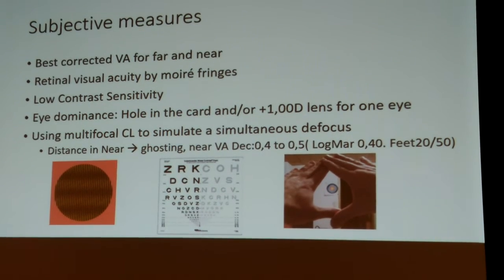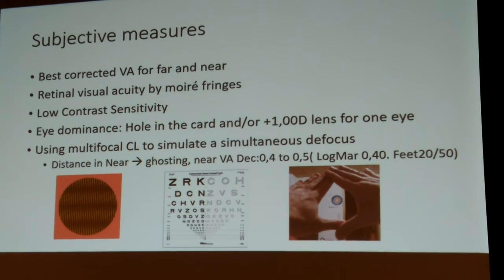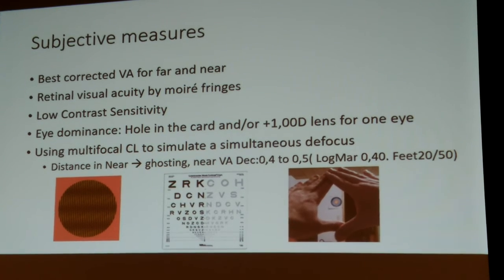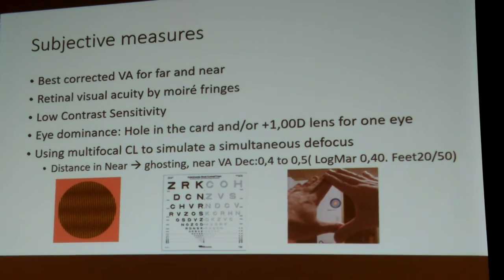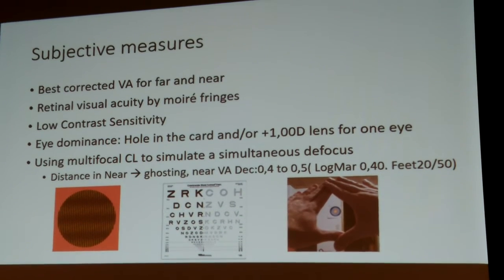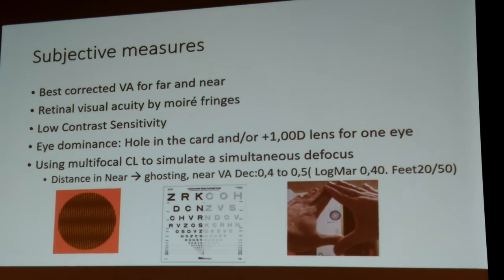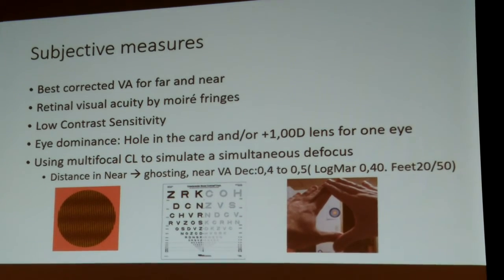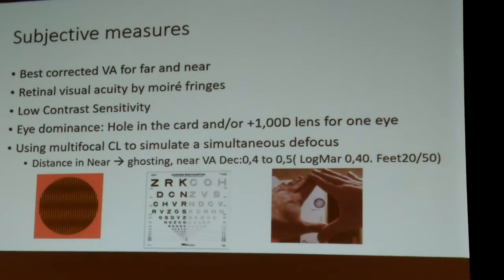For example, all the minus people, the myopic people, if he comes in with still a decent visual acuity, but he always removes his lenses for reading because he's -4, you can tell them already, right at the beginning, even with a multifocal lens, your reading won't be that good after surgery. And so he has to understand that. If you don't tell him, you will probably have an unhappy patient afterwards. So these things you have to discuss with them.